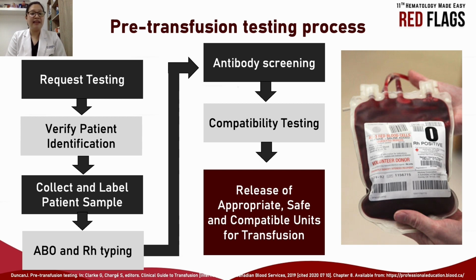The patient's blood typing or ABO grouping is performed by ascertaining concordance with both cell typing or forward grouping and serum testing or reverse typing. RHD typing involves testing the patient's red blood cells for the presence of the RHD antigen with the anti-D sera. RHD negative patients may develop antibodies to the RHD antigen if exposed to RHD positive red blood cell. It is therefore preferable to provide Rh-negative blood components to any RHD-negative individual.